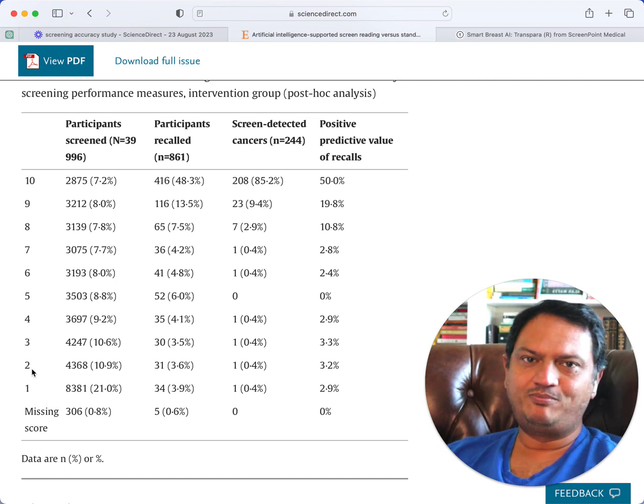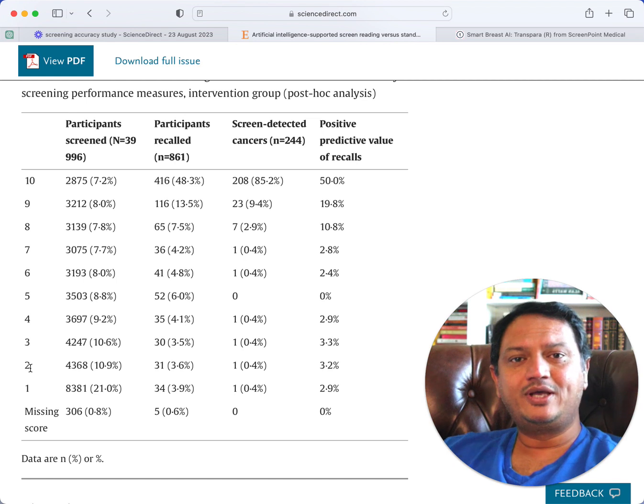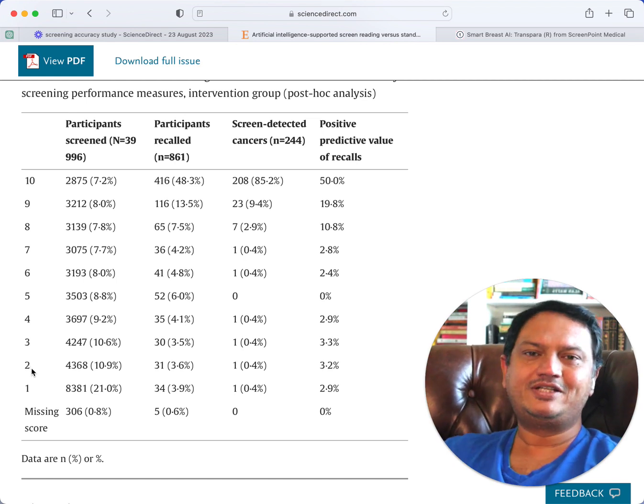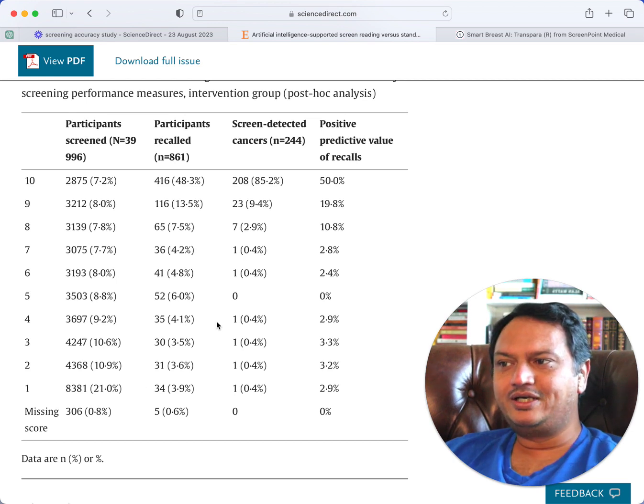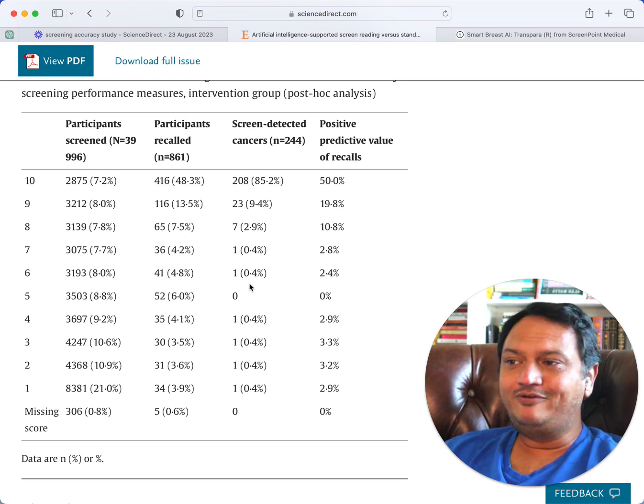And the AI is just saying, oh, low risk, and a single radiologist looks at it, with a second radiologist not looking at it, and the single radiologist looking at the images without the evidence or support of the AI marking. And he's still recalling almost 100, or more than 100, like 200 patients or so. And out of these, there are a few cancers, not a lot, right?